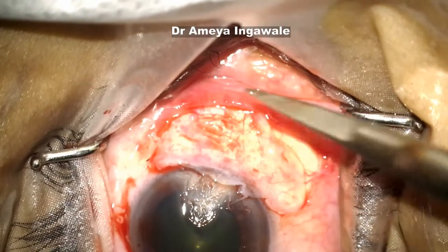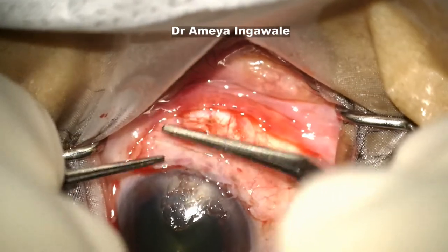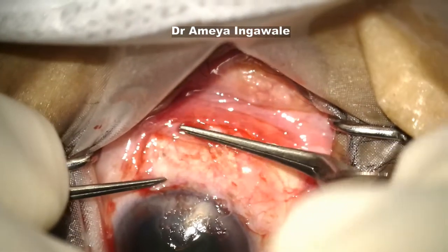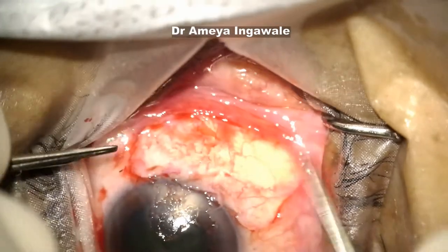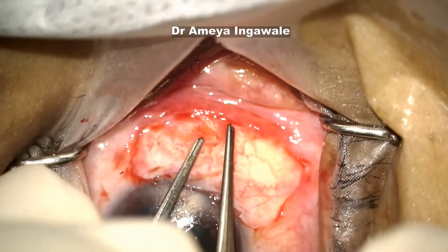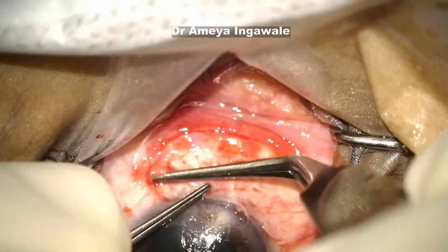Once you take the graft, keep it on that area and it is important to get the limbal alignment correct. For sizing of the graft, I had just eyeballed it, but it's always a good idea to mark it with a surgical marker. Once the limbal alignment is correct, spread out the graft.